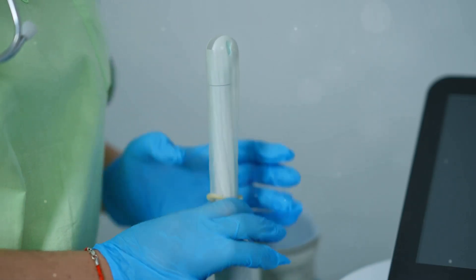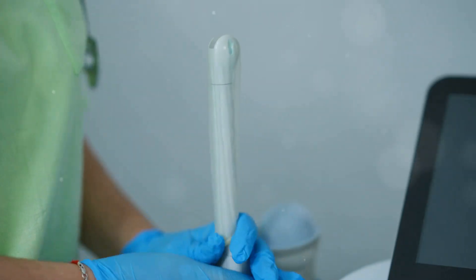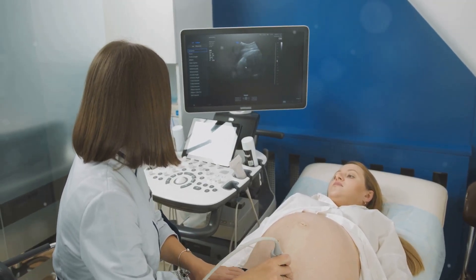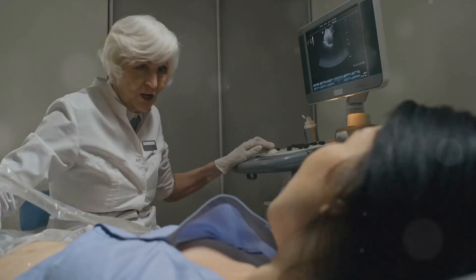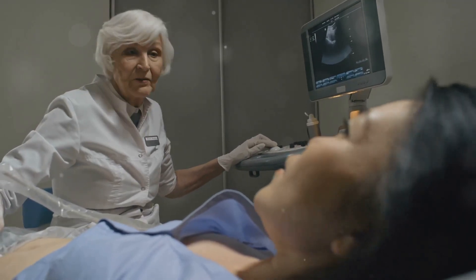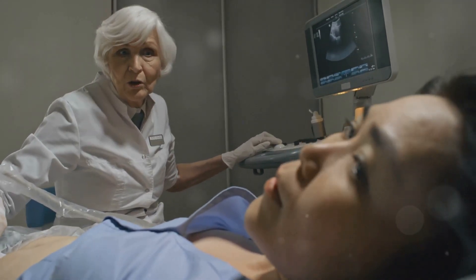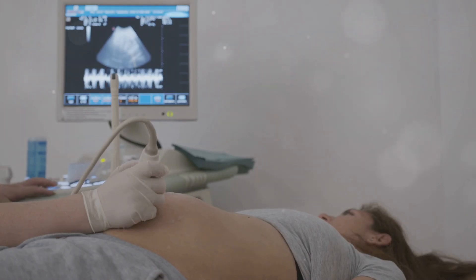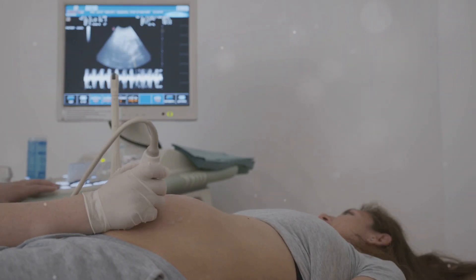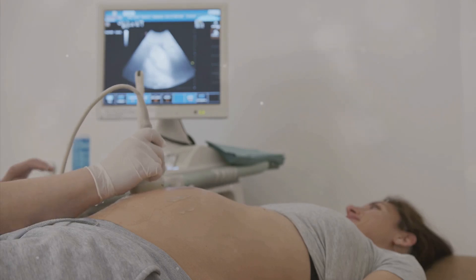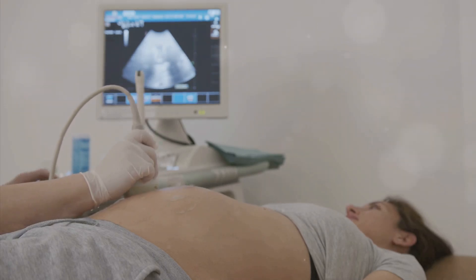Our journey begins with transvaginal ultrasound, a cornerstone in evaluating female reproductive health. A specially designed probe is gently inserted into the vagina. This probe emits sound waves, creating real-time images on a monitor. We closely examine the uterus, ovaries, and fallopian tubes.